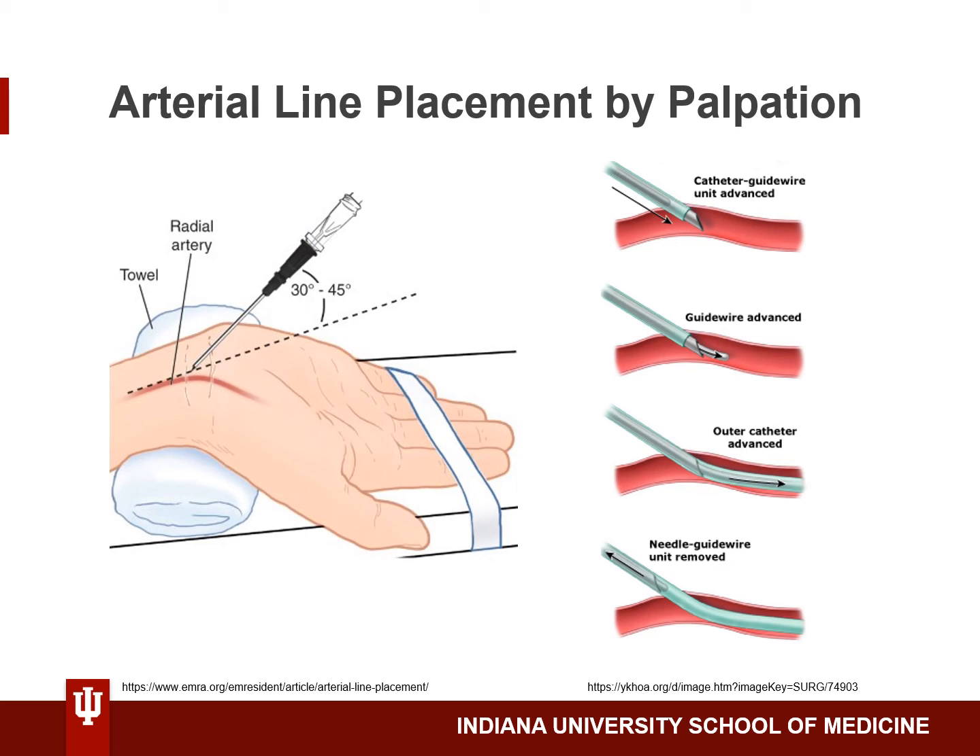Next, advance the catheter over the guide wire. You can then remove the guide wire and the needle, leaving only the catheter in the radial artery. You may have to place pressure proximal to the site to prevent a gush of blood when removing the needle and the guide wire.